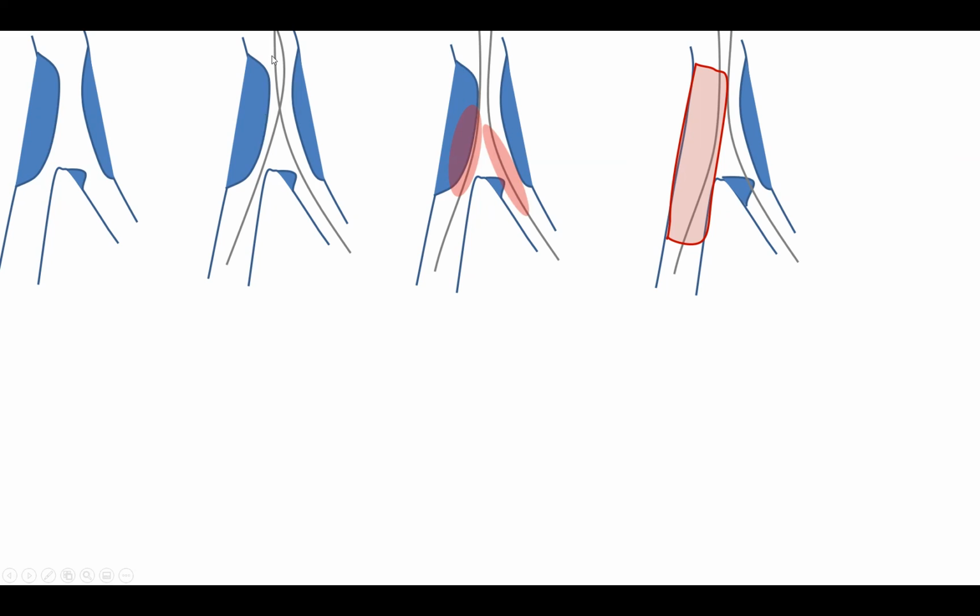It's important, if you can, to wire the more difficult lesion first. Like if the side branch is hard to wire, you should wire it first. If you wire the more difficult lesion last, then the complex maneuvering will make that wire twirl and spin, and it can wrap with the first wire. So you do the more difficult one first to avoid potentially wire wrap. When the wires wrap, you'll have a hard time advancing your balloons and stent across the wrapped wires, okay?